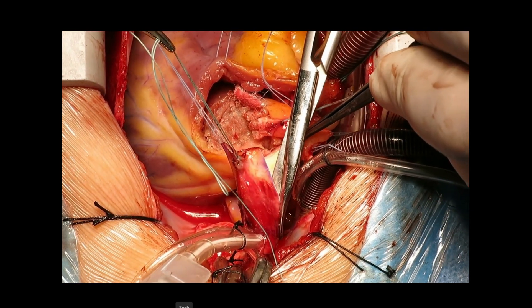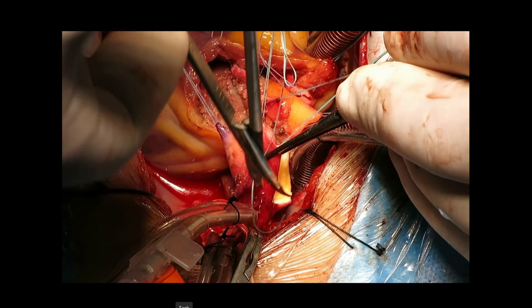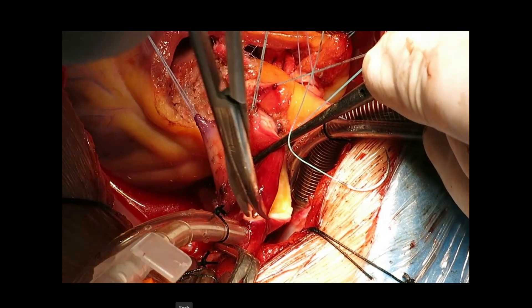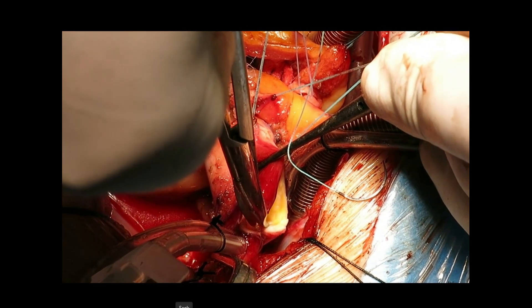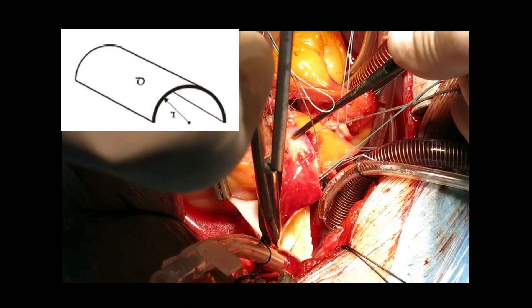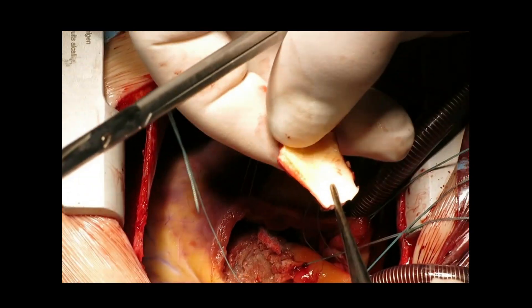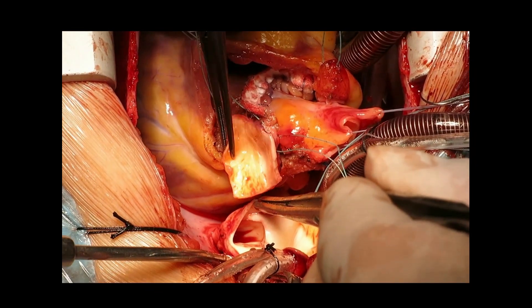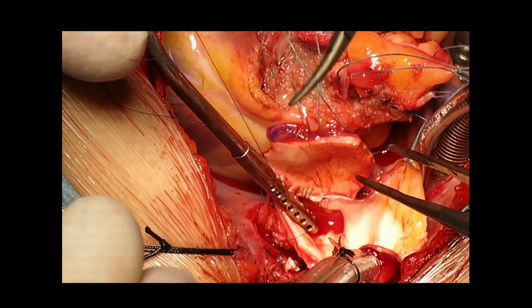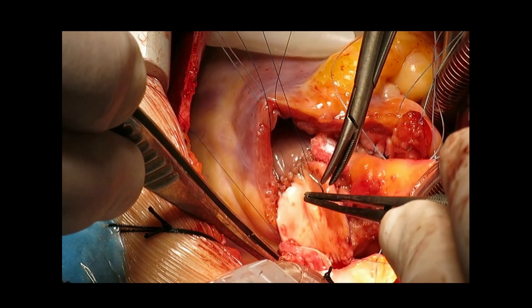Before positioning our valve, we construct the posterior RVPA pathway. The crucial point is to use live native tissue for at least half the circumference of this pathway to preserve the possibility of growth. The aortic wall serves as a suitable and predictable tissue for this purpose. So the anterior half-cylinder of ascending aorta is excised, sutured to the posterior border of the pulmonary artery stump, and then to the septal part of the autograft bed, completing the posterior wall of the pathway.